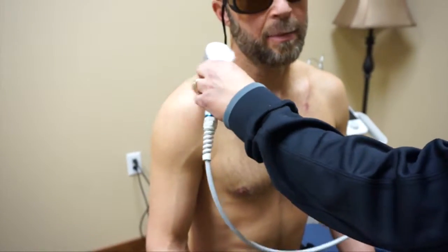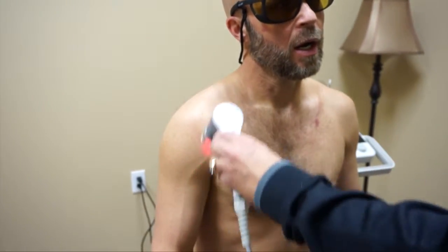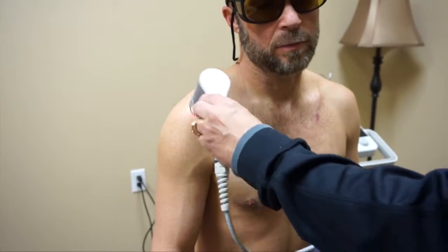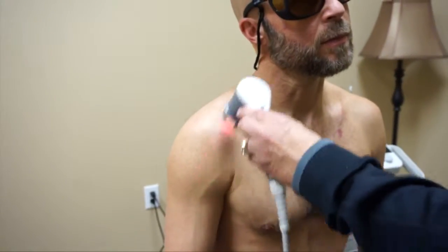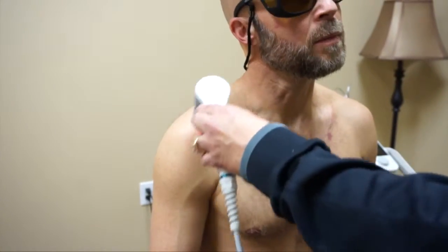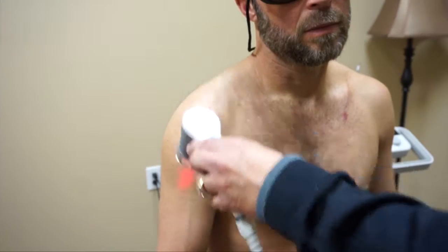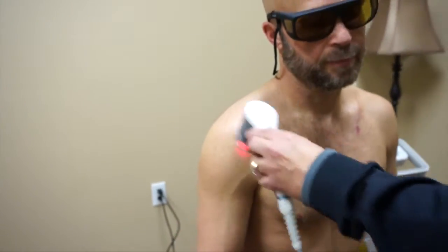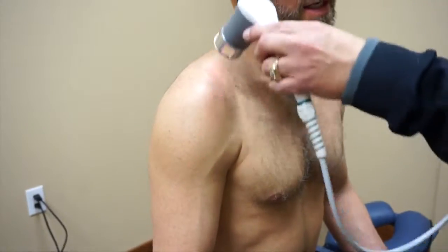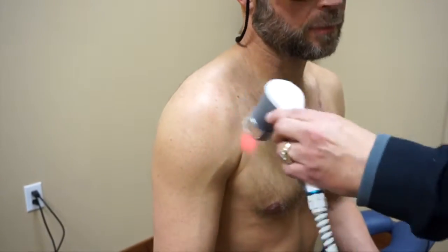Wavelength depth is determined by the laser's wavelength — this is a 980 nanometer wavelength. Each laser, as they get approved by the FDA, has to pick a wavelength and get it accepted. This one goes from zero to 60 watts of power, and I chose 40 watts. The wattage determines the speed and delivery of the photons into the tissue.